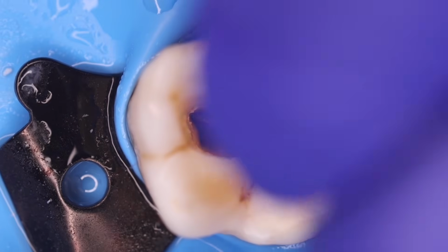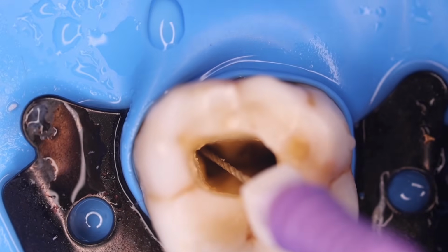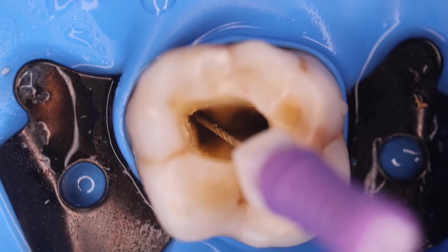So going mesioangularly, we will be able to locate this mesiobuccal canal orifice 1.